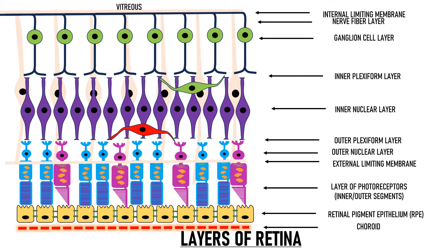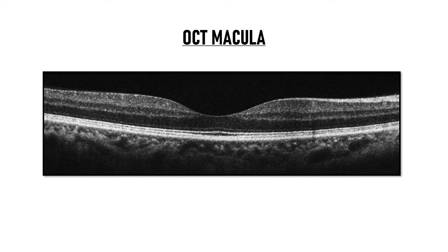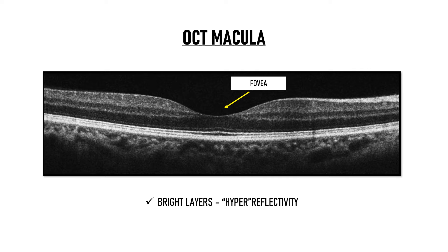So with this basic understanding, let's see this picture of OCT macula. We know this OCT scan is taken through the macula because this depression here corresponds to the fovea, which is the center of the macula. As you can see, there are many bright layers and many dull-looking layers. These bright layers imply hyper-reflectivity and these dull layers imply hypo-reflectivity, so there are many hyper-reflective and hypo-reflective layers in the retina.